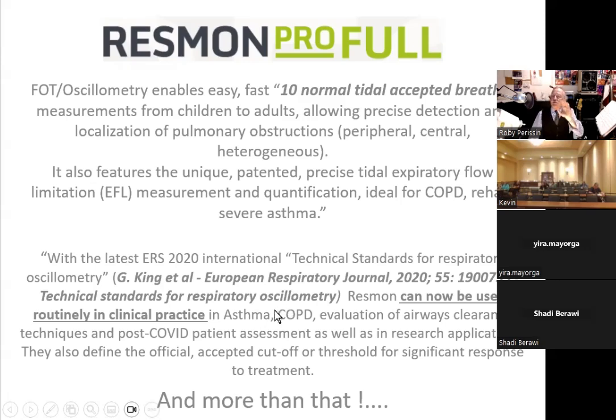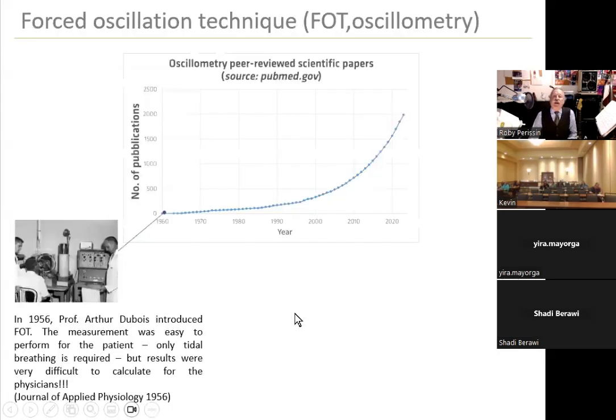Again, very important, we now have internationally recognized technical standards from a very major group of the ERS, with many participants from the ATS. Now, why is it the right moment now? Because it is not a new test. It's established and validated, with thousands of papers describing forced oscillation techniques since the 1950s. So it's not an experimental device. It was restricted until today only to research or only to patients that could not possibly perform a spirometry.